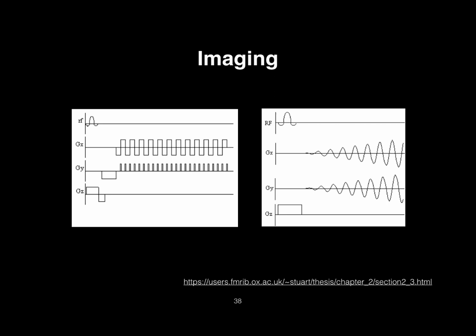Does it? So the time that you spend collecting K-space is, so I can speak practically for what most people are doing right now. The time to acquire, say, a 3 millimeter echoplanar scan is on the order of maybe 30 to 40 milliseconds right now at our 3 Tesla scanners. Okay, but that is one slice worth of data. And then you have to spend a little bit more time with encoding. So say you have 50 milliseconds per slice that you need.